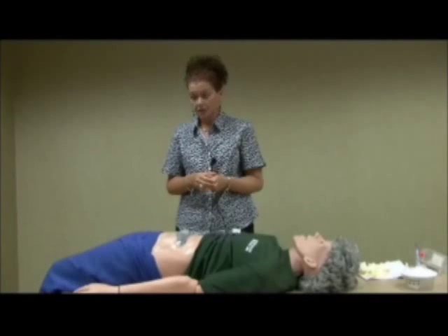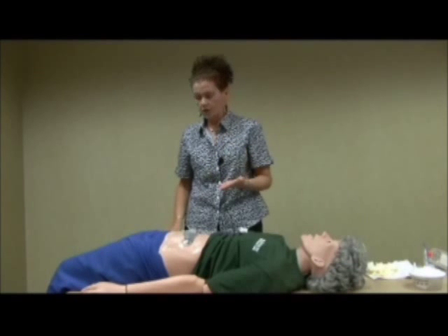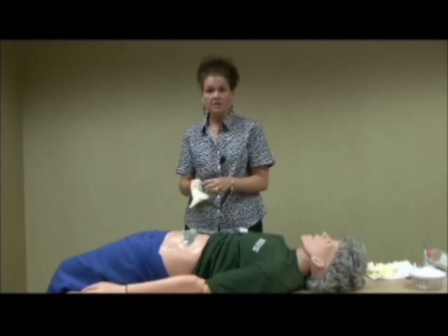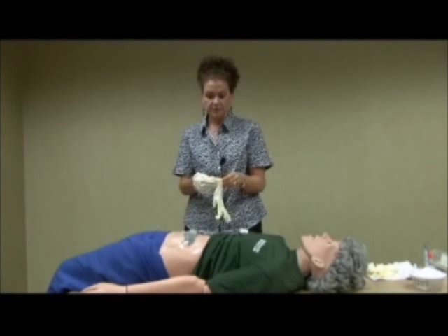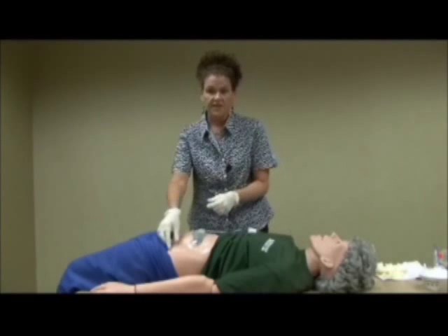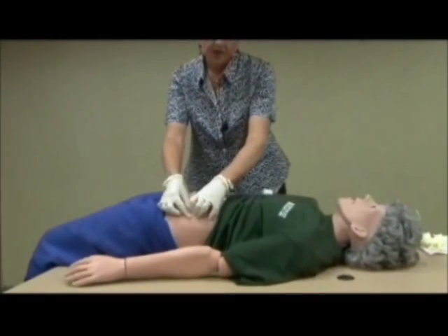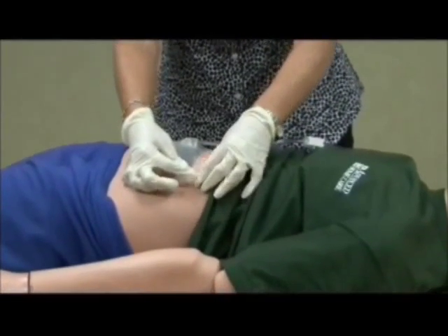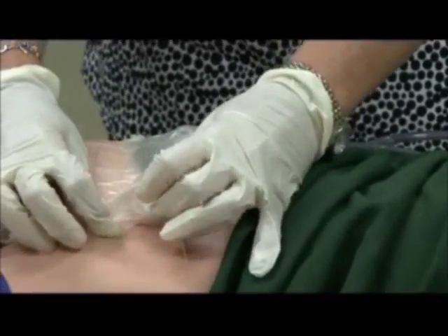Before you remove your dressing, you'll want to wash your hands either with an antibacterial scrub or with soap and water. Your home health nurse should provide you with gloves, either a box of gloves or gloves in a pack, and you'll want to place gloves on your hands before changing the dressing. Now you're ready to remove the dressing. You're simply going to lift the transparent drape from the wound edges. You may need to use an alcohol prep or some type of moistened gauze to assist you with this process.